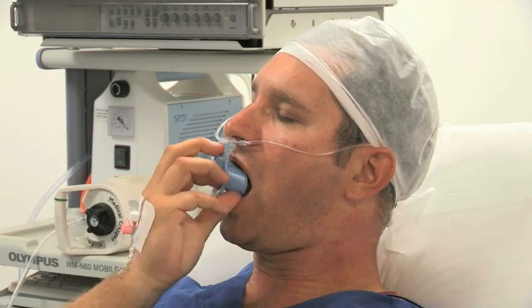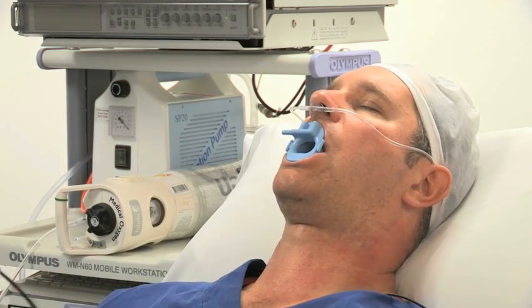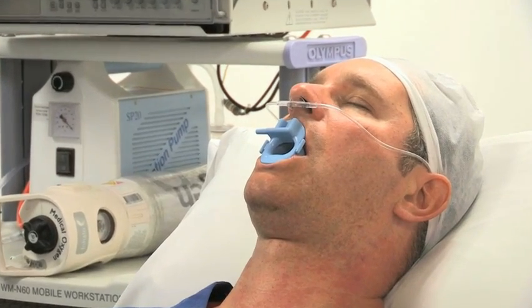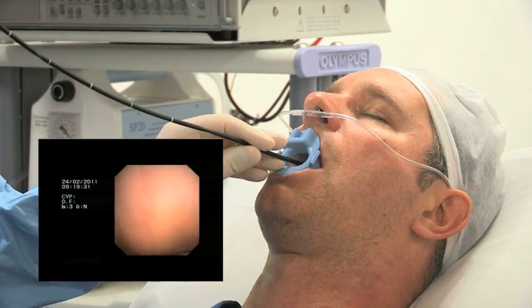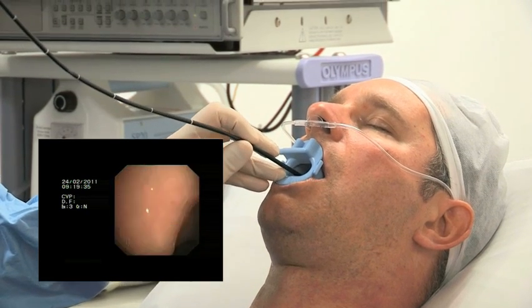If the airway is still not tolerated, use a small, round bite guard instead. Some form of bite guard is essential, as the need to bite down if gagging is very strong and easily damages the endoscope. With the oral route, it can often be difficult to maintain a midline scope position, hence the benefit of an oral conduit.